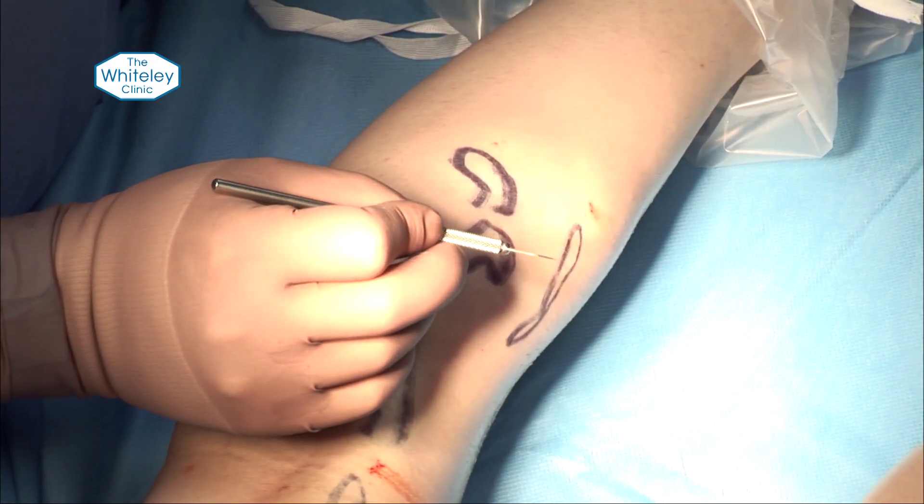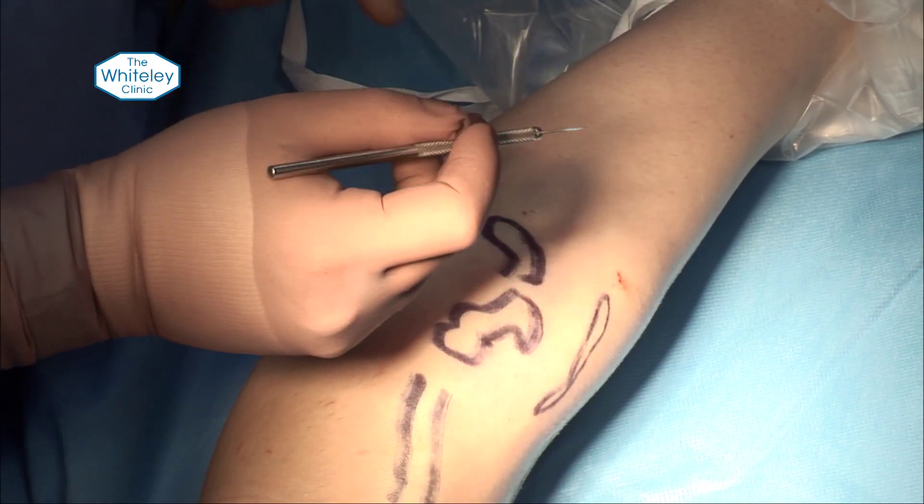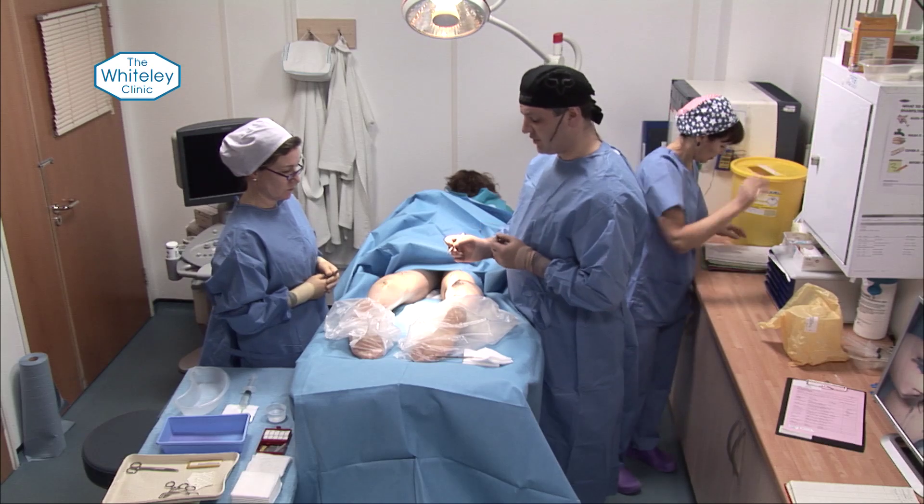What we use for the phlebectomies is a very, very small blade as you can see here. This is a beaver blade that's used in eye surgery. It gives a very, very delicate little incision with very clean edges, which is virtually invisible.